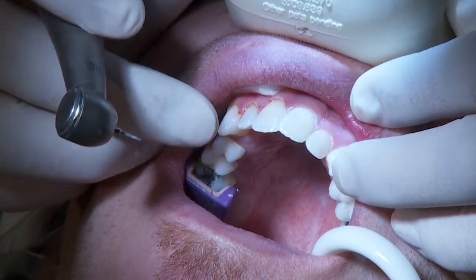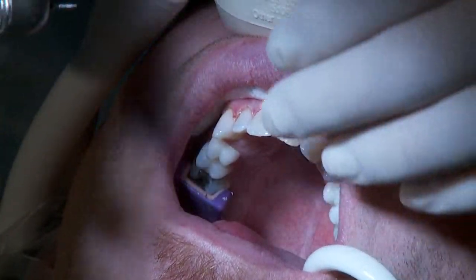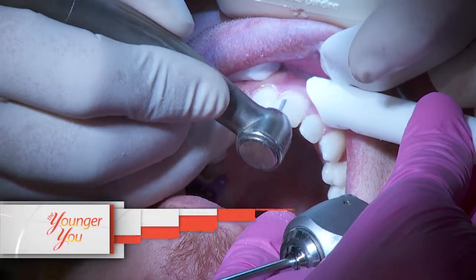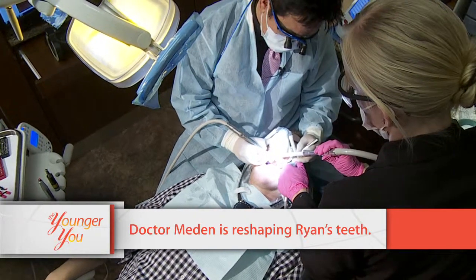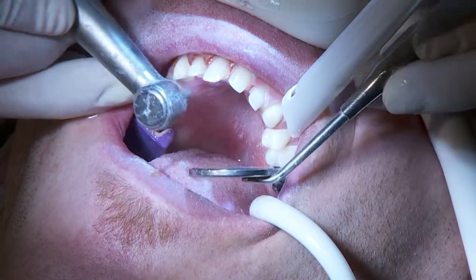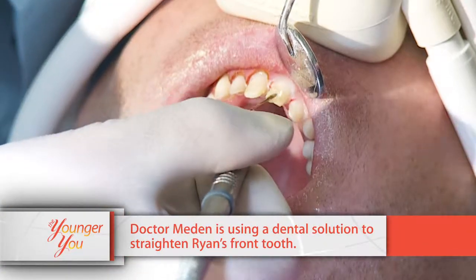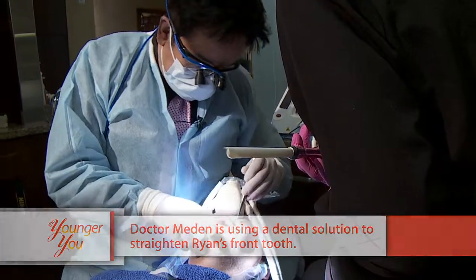Some of his teeth have rotations in different ways. There's some rotated more toward the inside of the mouth. That's how we're going to actually trim some of the teeth. I'm shaping the teeth right now still, continuously touching them and seeing which is the way that I need to give them the best look. So we're just gonna straighten the tooth by doing this. You're gonna look like $1,000,000, man. Yeah. You're gonna look really good.